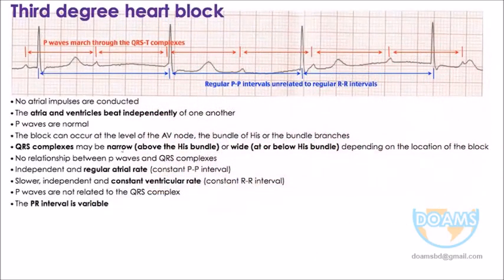Now this one. Total separation. What happened to the P wave and QRS? Identify the P. Do you think that the P wave is conducted by a QRS? Seems to be right somewhere here. Maybe here it is. It seems that this P is conducted by a QRS. The ECG is showing that now the P is not conducted. This P may be conducted, but how can we say that they are conducted? P should have a PR interval. Is there any PR interval? No, it is destroyed.